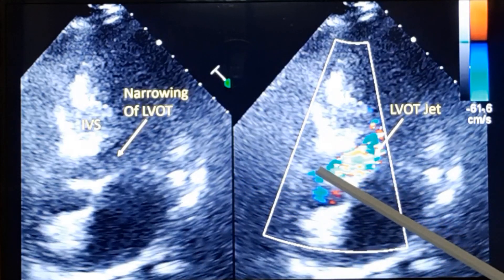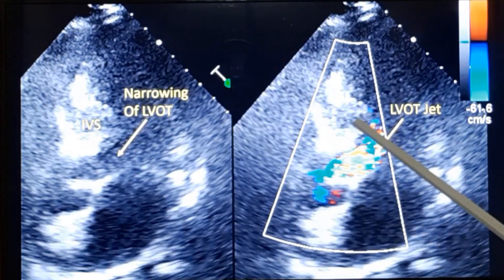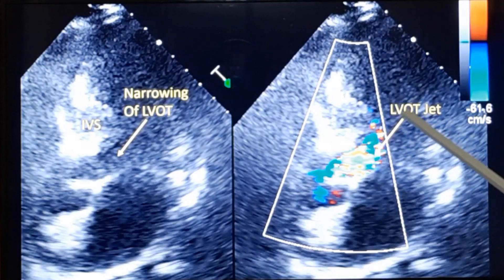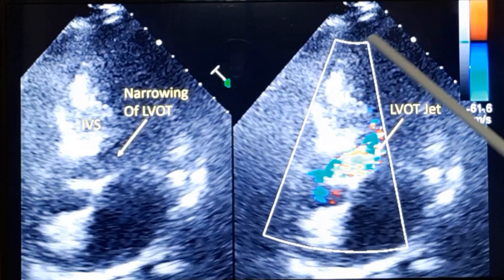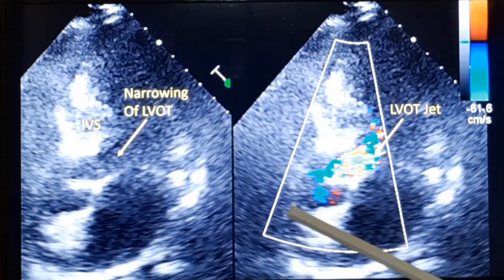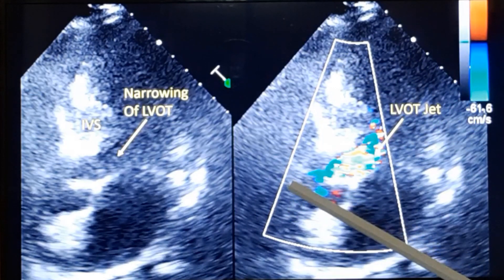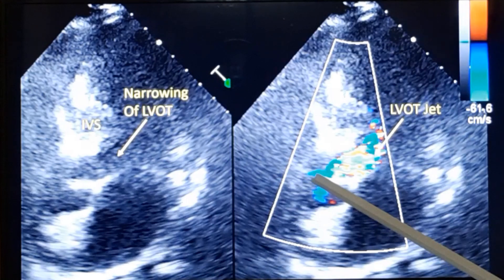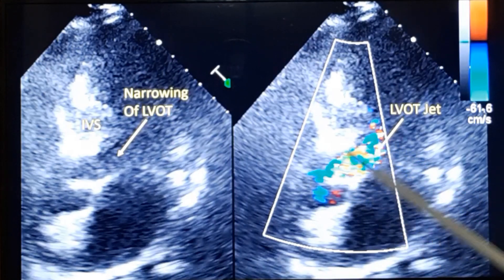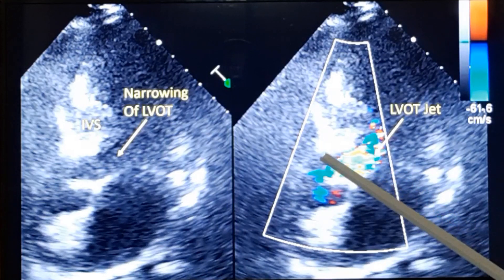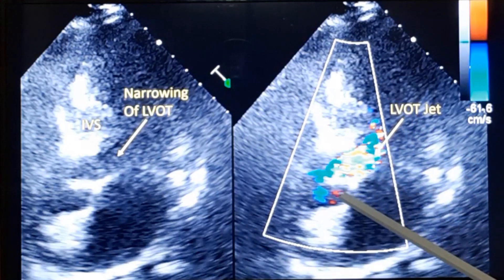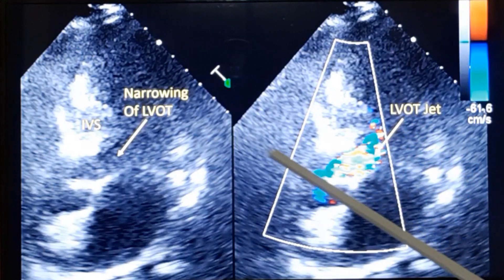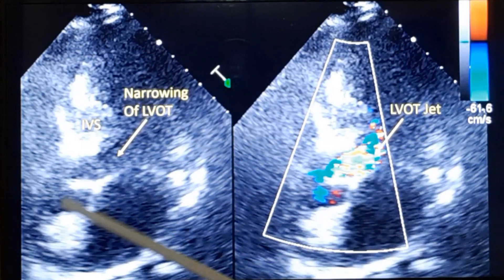Thickness may not always be in the septum. Sometimes there is a variant of hypertrophic cardiomyopathy which is non-obstructive with apical thickening. Apical thickening alone can also manifest in hypertrophic cardiomyopathy; those cases will not be obstructive and this gradient will not be present. So there are various types — obstructive and non-obstructive.